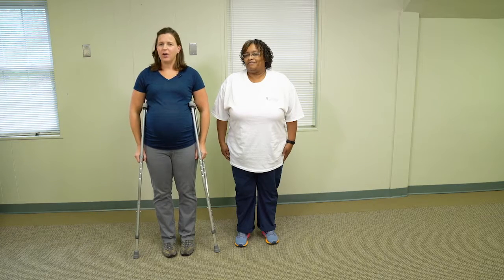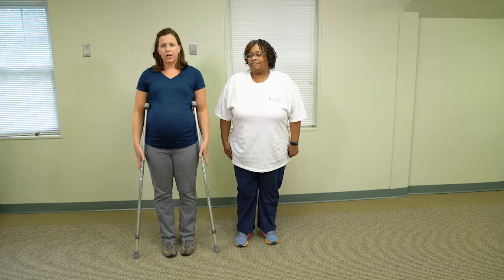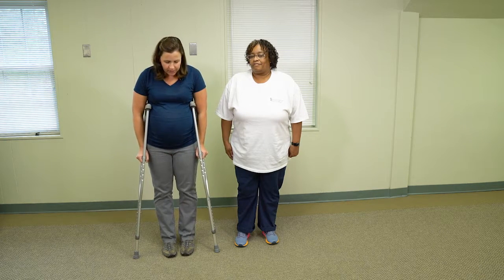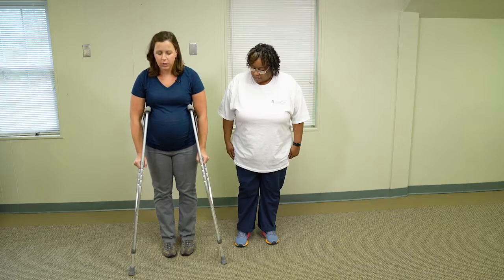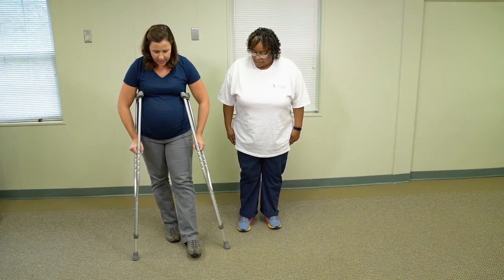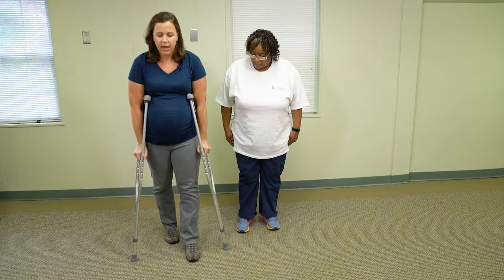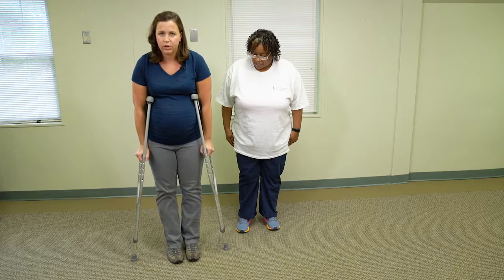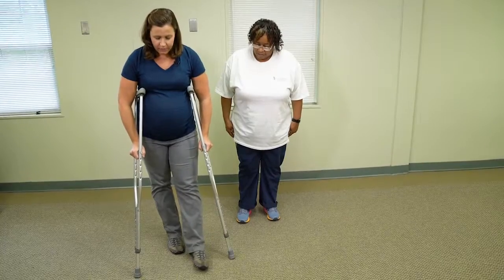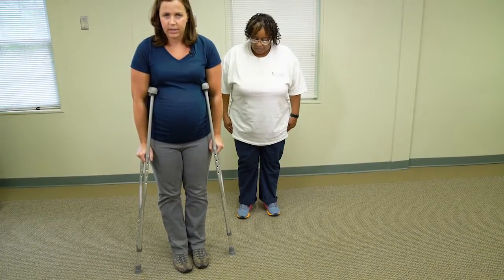Now we're going to teach you how to walk with the crutches. When you're walking with the crutches, the idea of the crutch is to take pressure off the leg that is affected. You're going to place the crutches out in front of you just a little bit, and you're going to take a step with the affected leg. And as you take a step, you're going to push through your arms to take pressure off of that leg, and then take a step with your unaffected leg. So it's going to be crutches, affected leg, pushing through the arms, and then your unaffected leg.